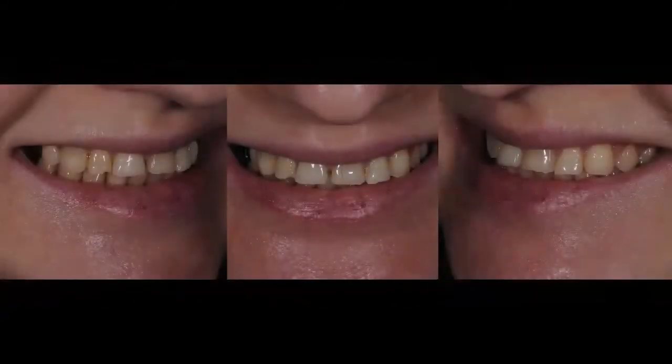Now, I'm going to show you the before photo. This is how I received this patient before we did the full mouth. And this is a very complex case. So we did bilateral sinus lift. There were some implants, 6 implants placed.